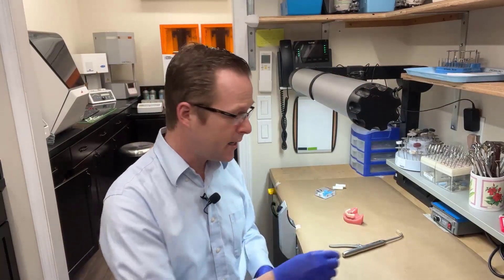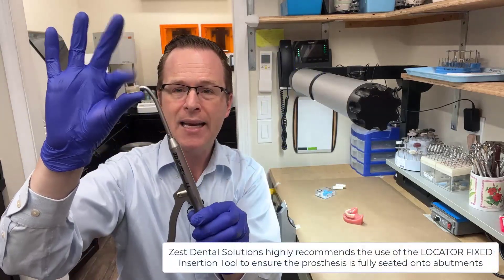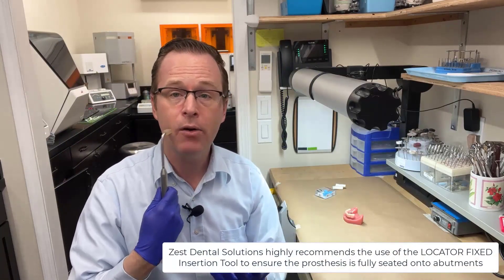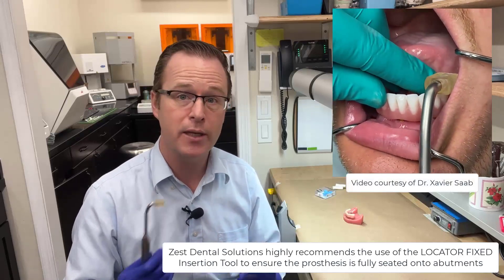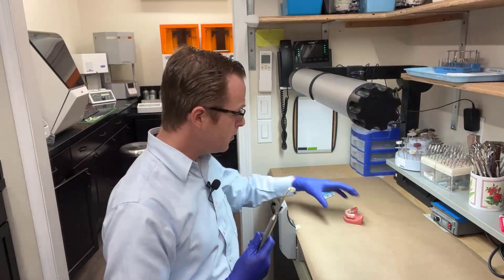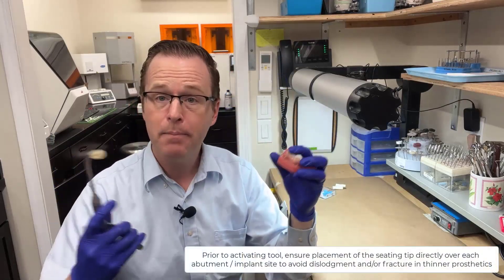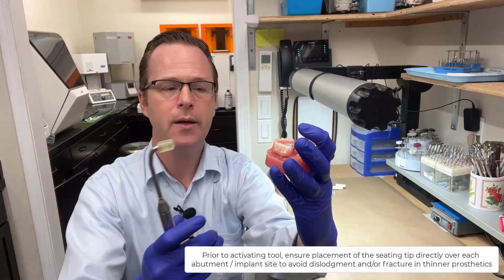Finally, there's the locator fixed insertion tool from Zest. The insertion tool is a crown and bridge tapper-like tool with a padded end. You can take this tool in the area where you'd like to double check that your locator fixed prosthesis is fully engaged, and just tap three times. It doesn't make a large force, just a little bumping force. You tell the patient they'll feel a little bump, and then you go click, click, click, holding it into place.